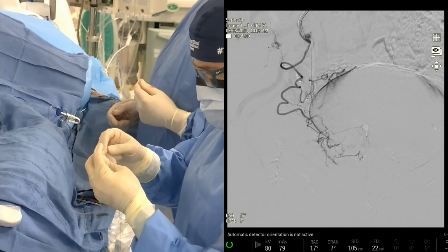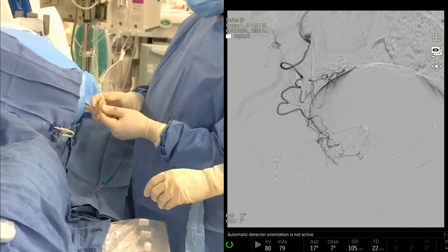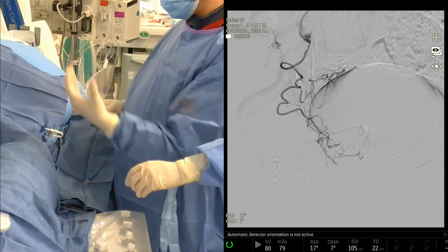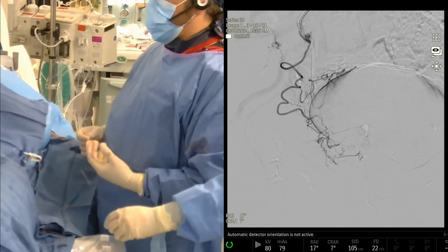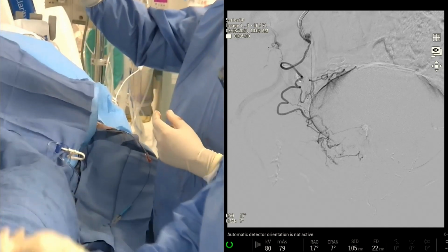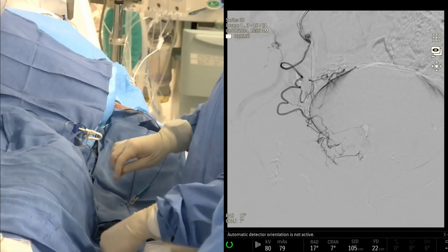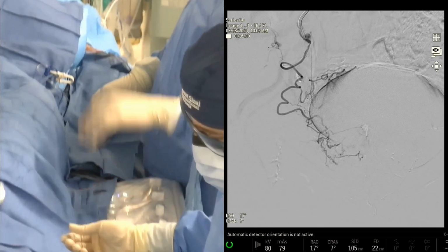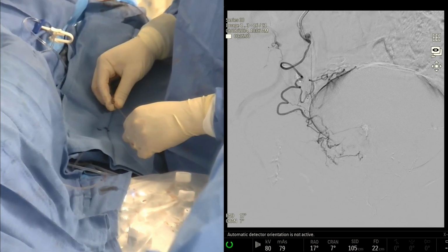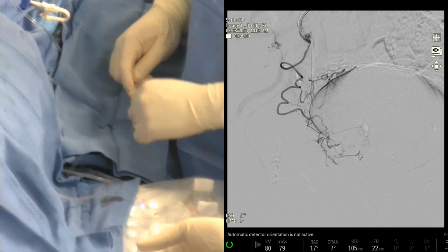Now, if you had a balloon, you could theoretically fill those branches by using the intraprostatic circulation to try to send some of that embolic through. Pressurize it lower. With an end hole, you typically can't do that. At what point are you trying to go after those branches? I mean, like you said, if it's coming off of the rectal, it may not be feasible. It's not that we couldn't do it. The risk is that we get a fair amount of non-target rectal ischemia if we really get distal into that spot.